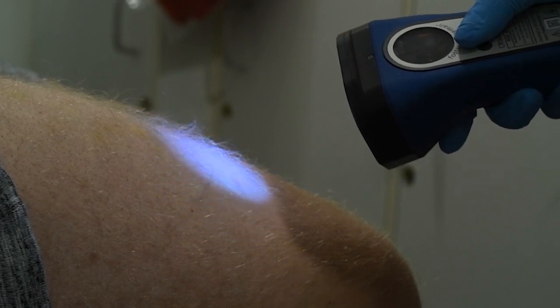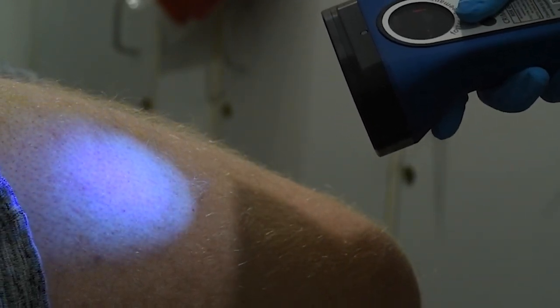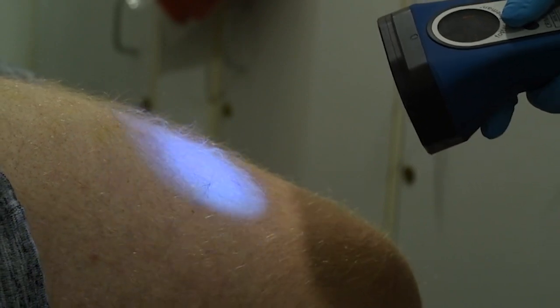These wavelengths can be really effective in searching for injuries and potentially giving visualization to injuries that aren't visible with the naked eye. Often what might happen with an injury is that as it fades, particularly bruising, it's no longer visible or only faintly visible on the top layers of skin.